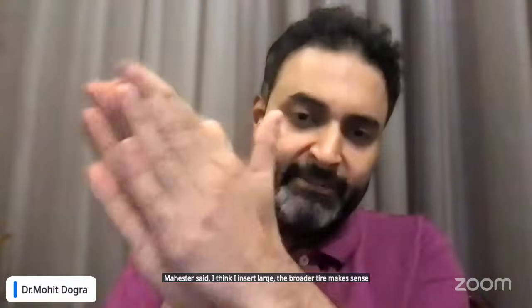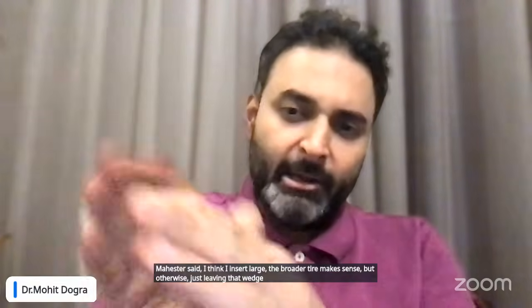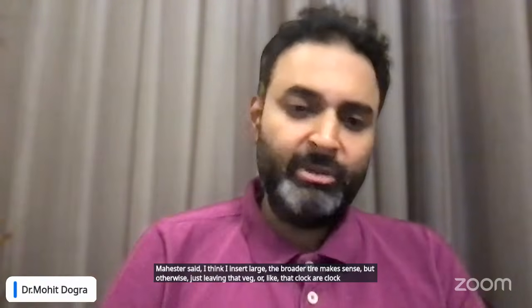But otherwise, just leaving that wedge, like a clock hour and a half, does just fine.